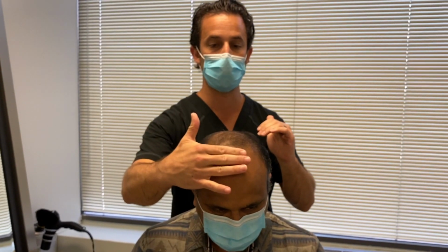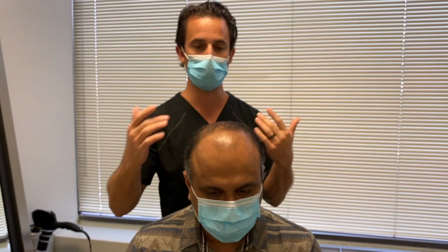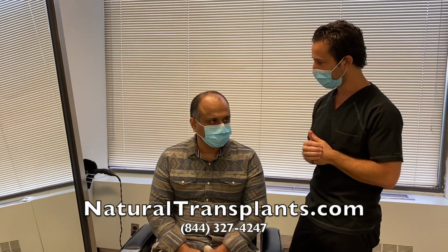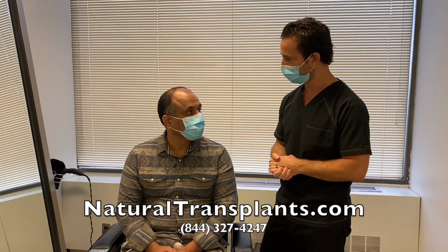The other option would be we could fill in the frontal third, skip the bridge, do the crown, or just go from the front as far back as we can go. But we did talk that it may be difficult to fill in the whole area of loss in one procedure, which typically takes at least 2. But we're going to do our best today, try to get that plus done, and go from there. Sounds good. All right, excellent. So we'll do a little bit of drawing, a little bit of shaving, and we'll check back in and see the line. Thanks again for doing this. We'll check back in a little bit.